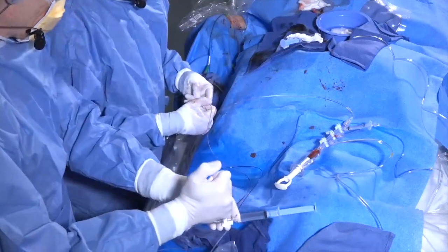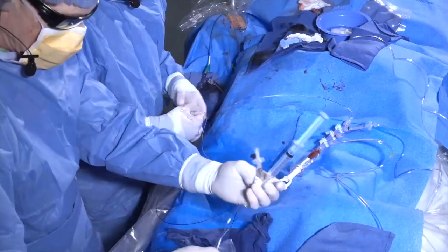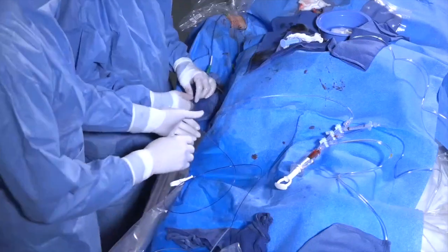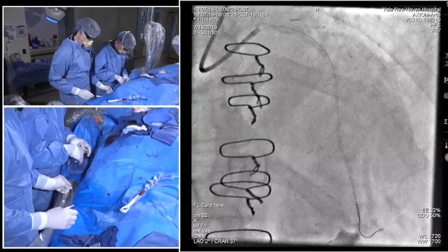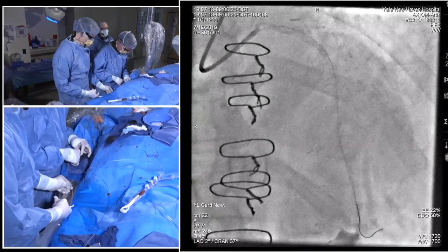Yeah, it's definitely something we've heard talked about at conferences recently, but it needs study. Even with the FineCross or the Turnpike, if you look at it afterwards, there are marks on it, which means we have presumably embolized things distally. So there's probably some debris. I would say we need a little more study before we start doing it.